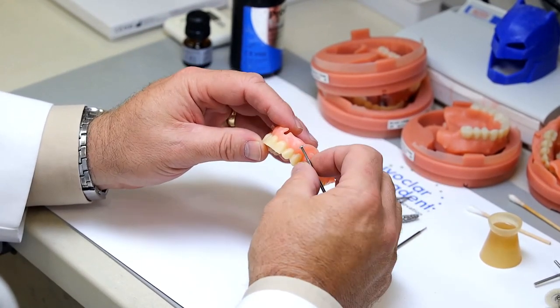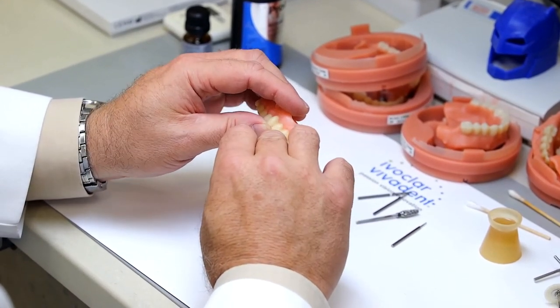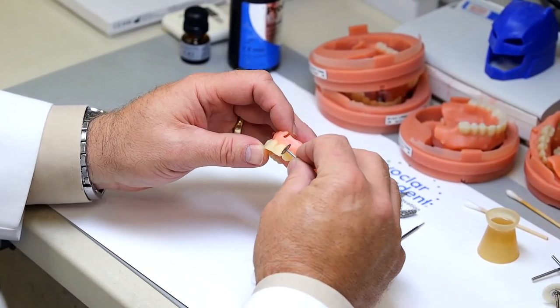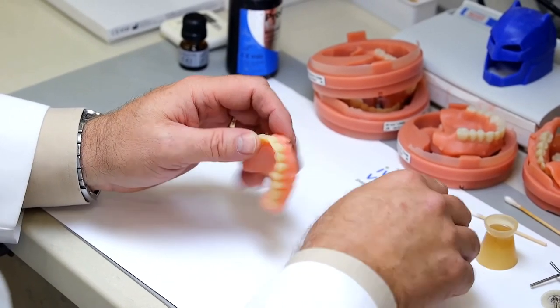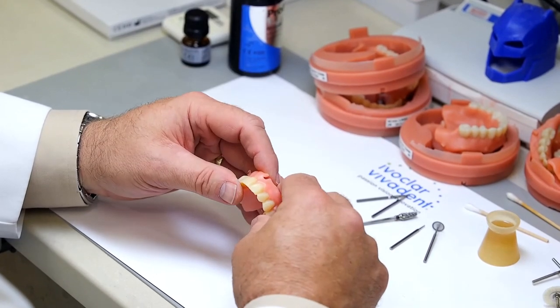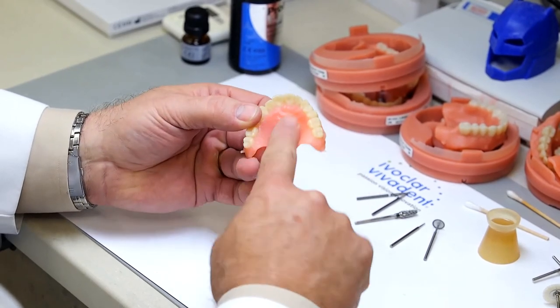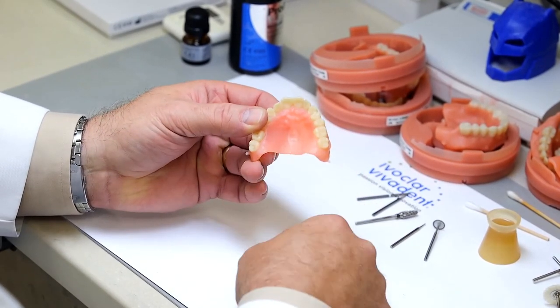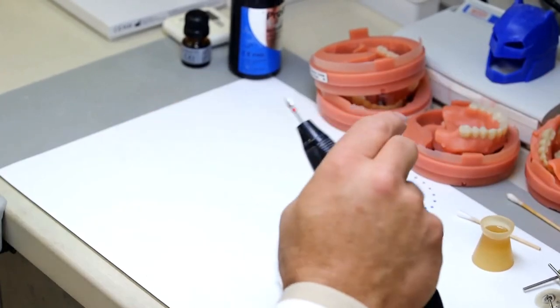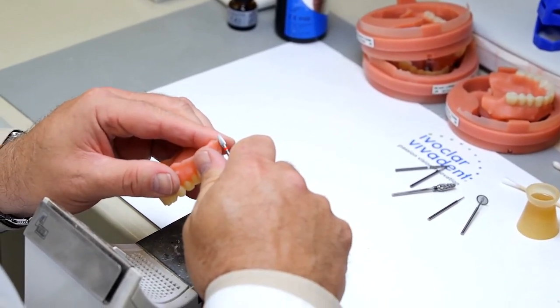So if we're talking a good, better, best denture, coming right out of the mill, obviously the embrasures are not fully opened. If you want to make it a little better, you can just come in here and gently open up those embrasures, and I'll show you how I do that. The others are polishers, and so in the laboratory you have what you're most comfortable with, polishing instruments. Really no need to go to pumice. You're already beyond the pumice stage here, so really all you need is just polishing devices. So let's go ahead and open up the suction and just take down those little bar attachments.